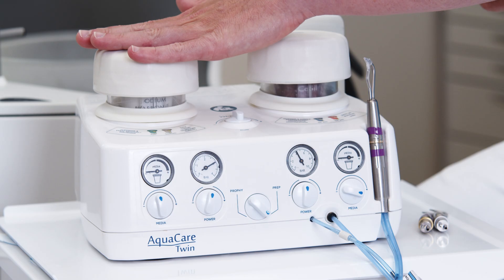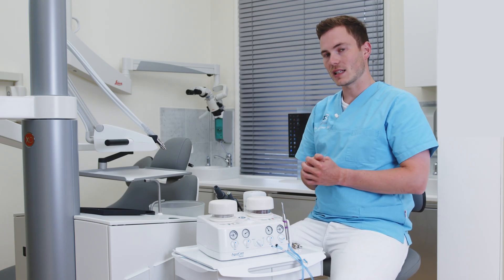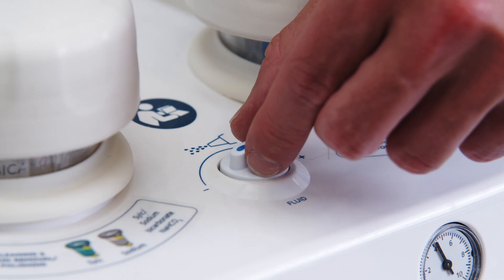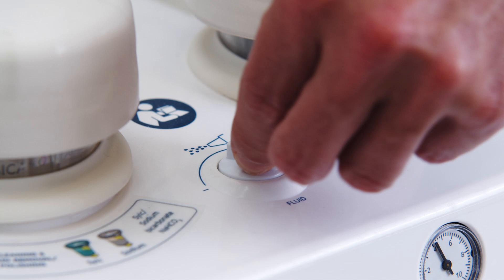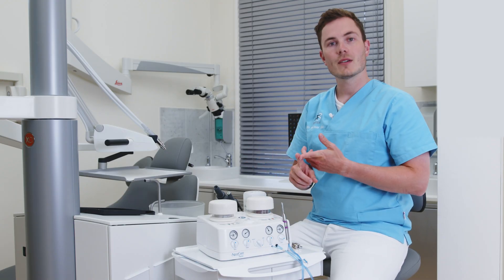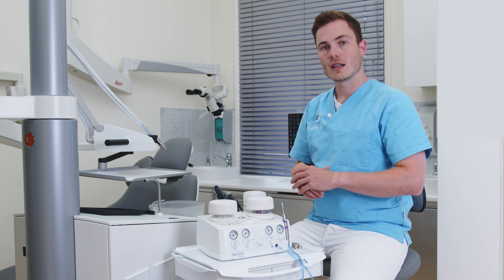I have those switches for the left compartment but also for the right compartment. I can also change how much fluid I would like, and that I can do with the switch on top. If I turn it clockwise I will get more fluid, and counterclockwise I will have less fluid — that's how I can control the pressure, powder, and fluid during the cleaning of the teeth or during preparation.